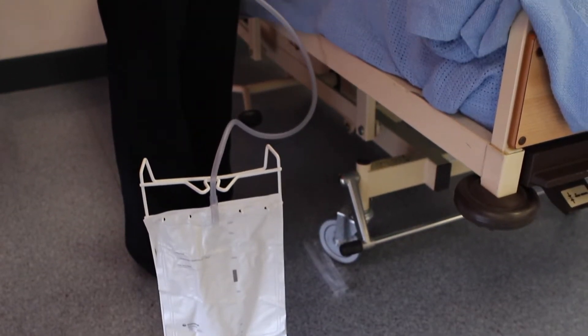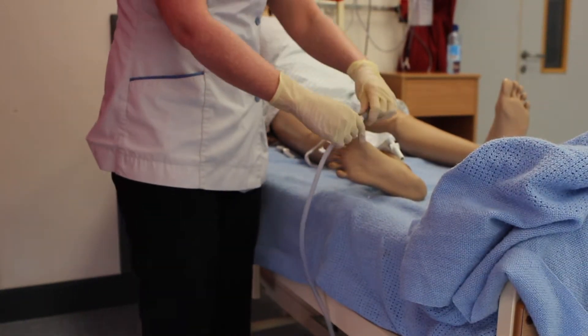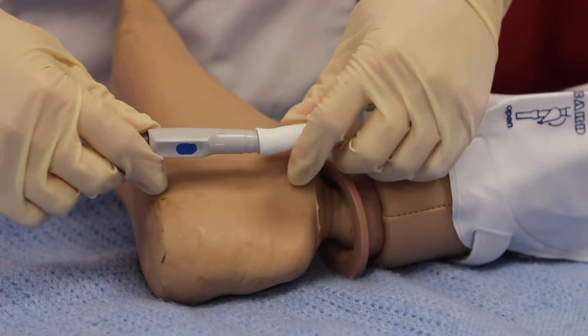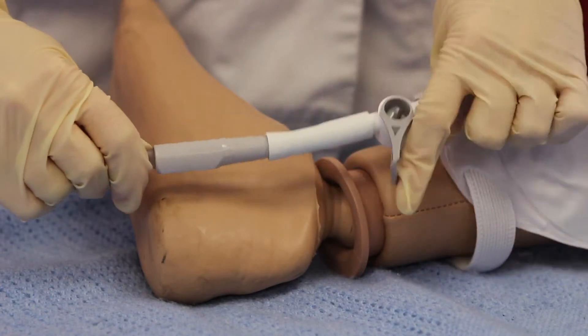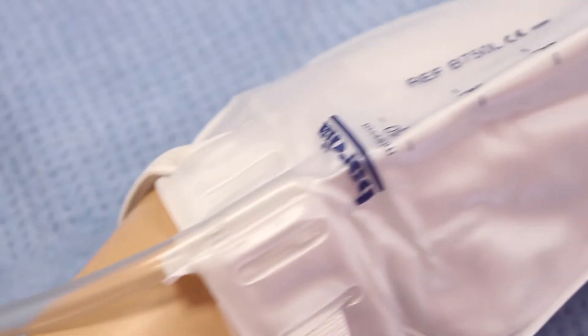Night drainage bags are used for excess drainage to avoid getting up during the night. To connect the night bag, remove the cap and connect to the bottom of the leg bag or flip flow, and position the tap in a downwards position to allow drainage into the night bag. By connecting the night bag in this manner you will reduce the risk of infection by maintaining a closed drainage system.